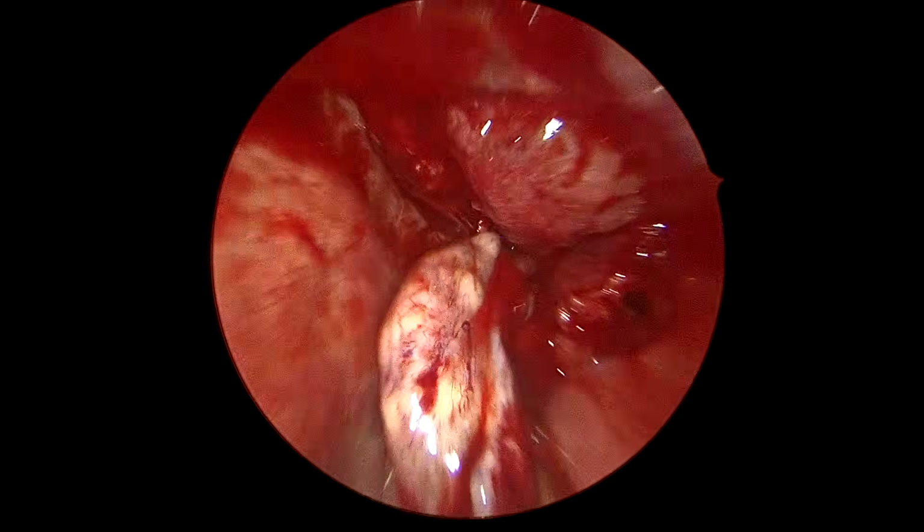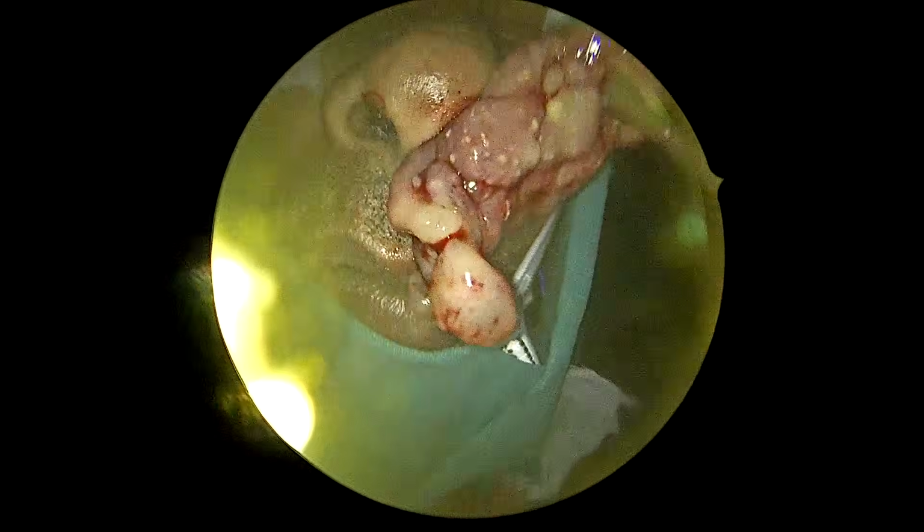Once I know that this mass is safe to take out, I took a Blakesley forceps and tried to remove it. It came out in toto. Now this is the mass. You can see how huge the mass is. It's a very big mass, and this man was suffering too much.